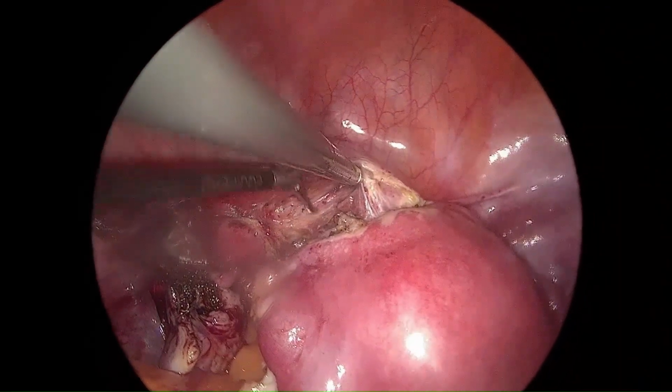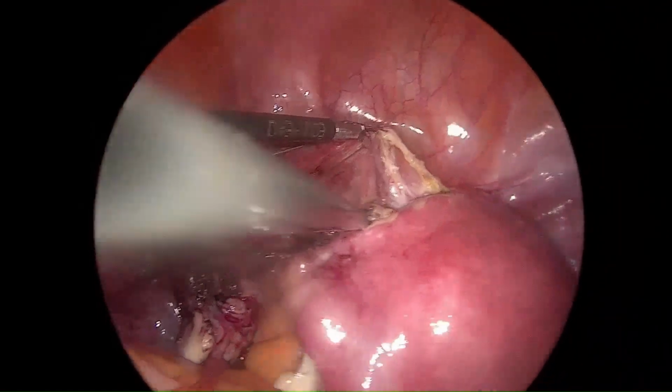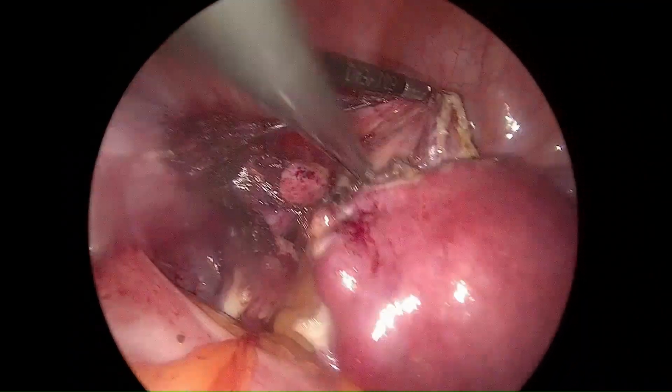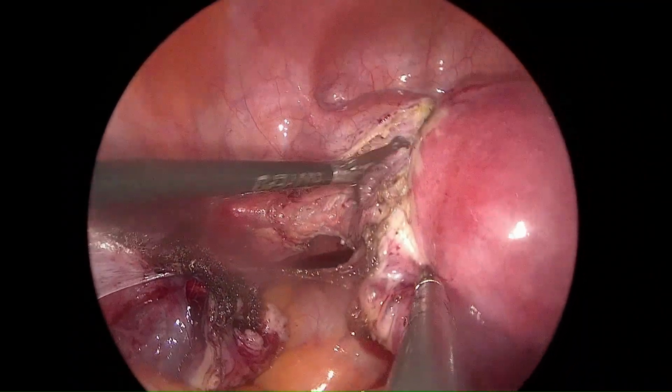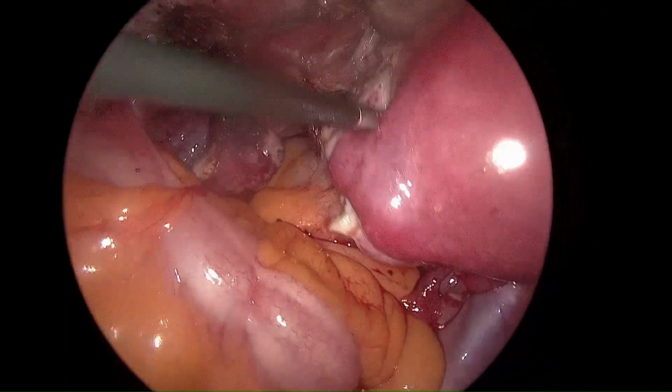This window has four walls: the roof, which is formed by the bladder, and the anterior portion, which is usually the scar; the posterior portion is the bladder again, and the floor, which is formed by the cervix.